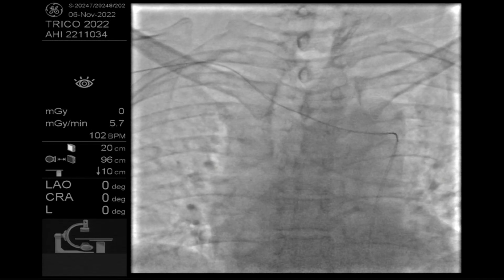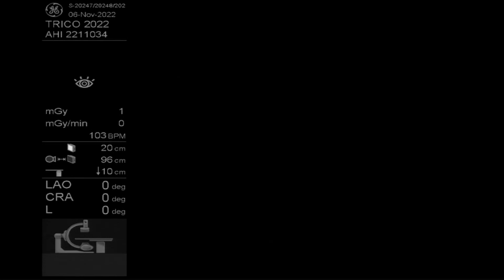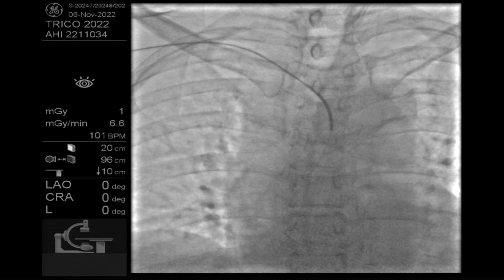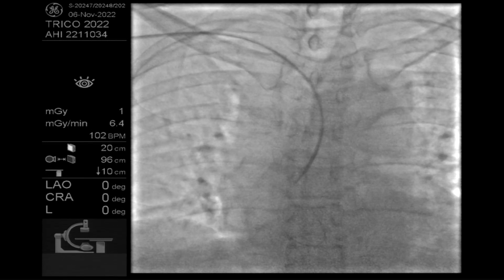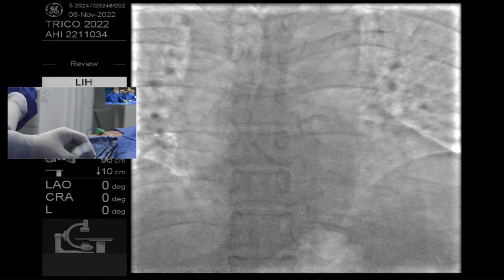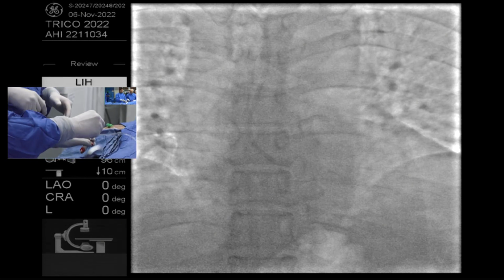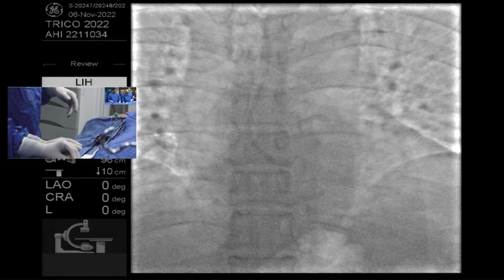Thank you, Dr. Patel. Here, first challenge is the loop. And for the younger colleague, you will have to show how you do over this loop. See, straight away, catheter is friendly. Everything is friendly. The guest faculty is friendly, and even the participants are friendly. Very nice. And true, our performer is also friendly.